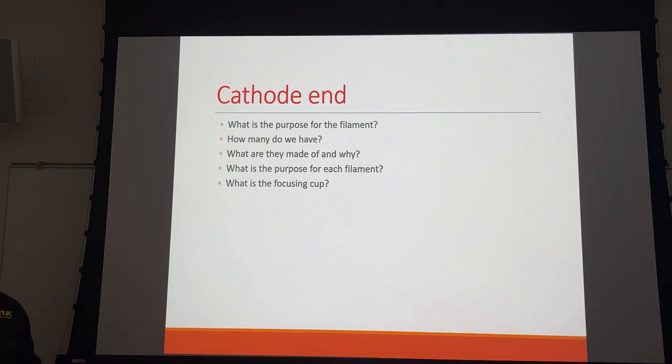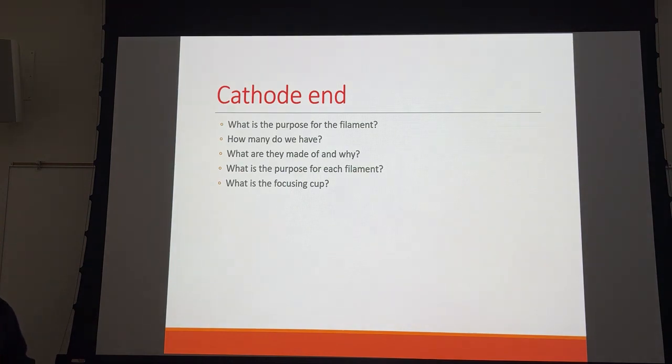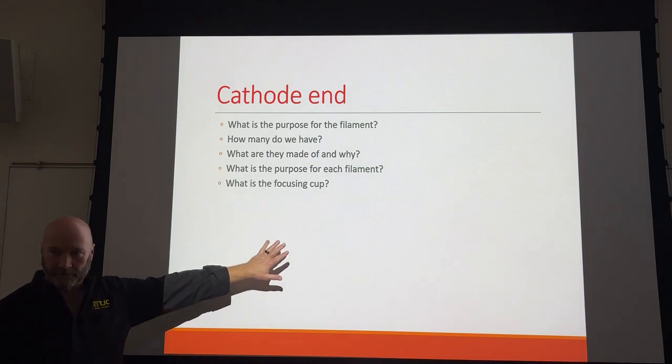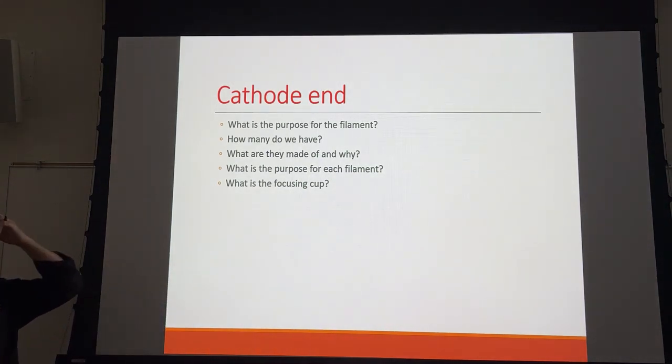So with a small focal spot, you've got tube limitations, but you increase your sharpness of recorded detail. Instead of shooting like a fluorescent light, you're shooting more like an incandescent light or a smaller light emitter. Okay, so you have two of them for those reasons. One for large exposures and one for sharpness of recorded detail.